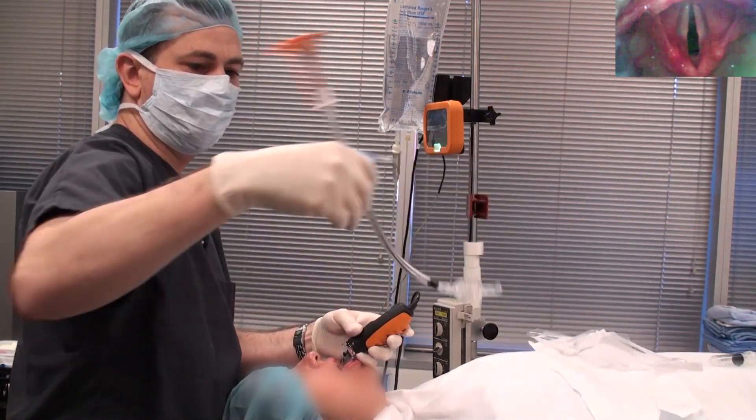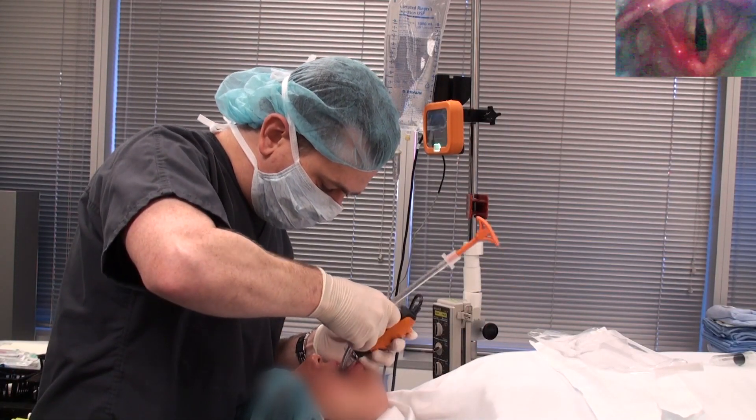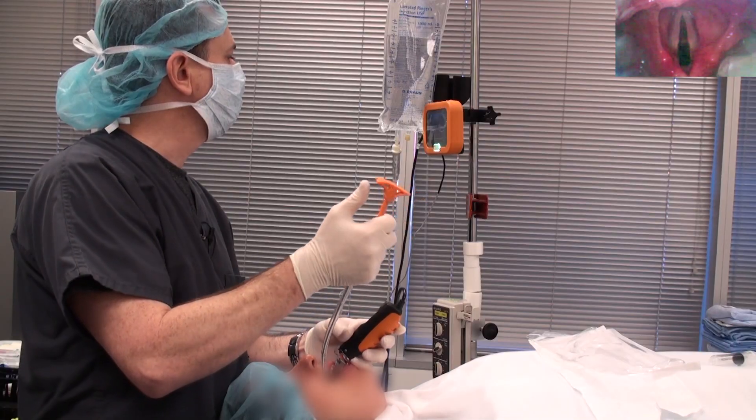Next, take your styleted endotracheal tube — I've got some KY on the tip of the tube. Carefully place this in the back of the mouth, medial to the back molars. Then what you want to see is the tip of that tube come into view in the bottom right-hand corner of the screen, right there.